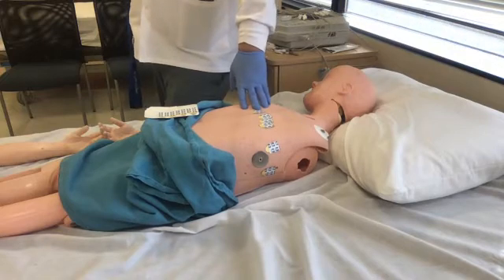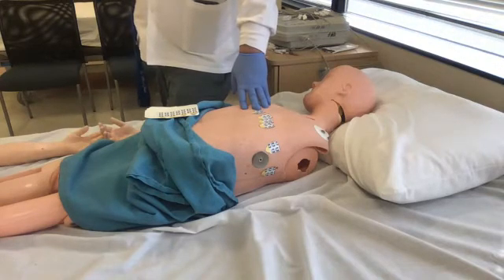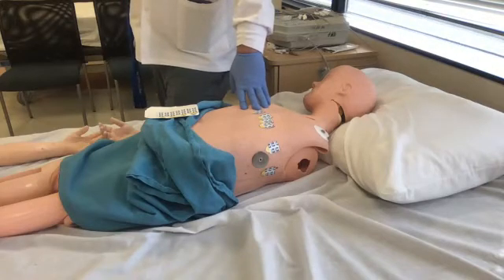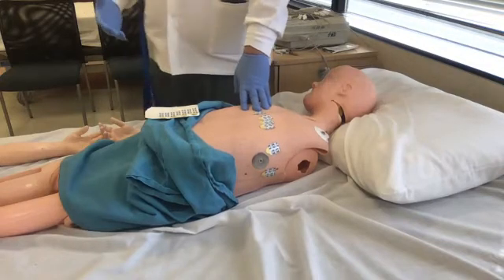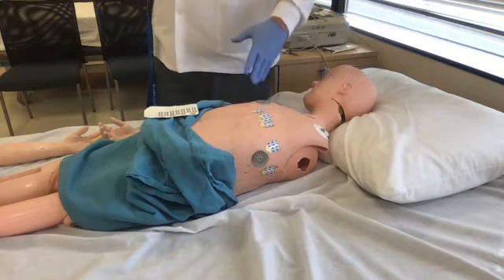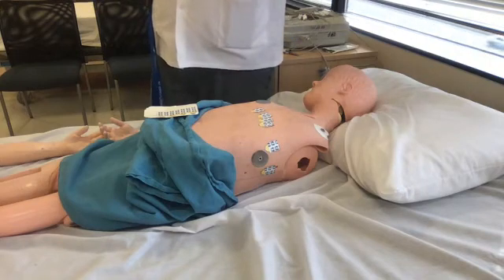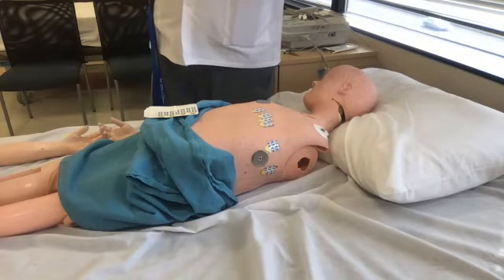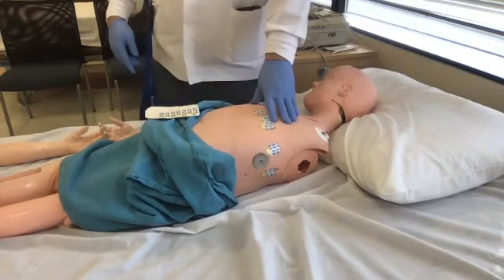And also, they did a lot of studies on patients who already had defibrillators. And you now know from the exam, if you have a defibrillator, it'll show a little spike. And that's a little big metal thing. So that little metal stud that's on the nipple shouldn't be too bad. And implants as well. I've had a lot of patients, a lot of students that had implants. It did not affect it. And you know, many people don't get the really big ones unless you're in porn or something, right? Their breast tissue was very stiff, and it made a nice contour to point the electrodes, and that's my experience, right?